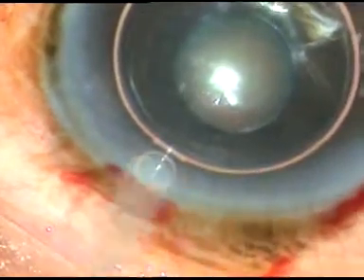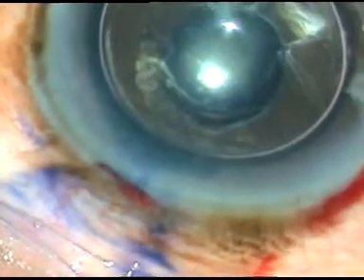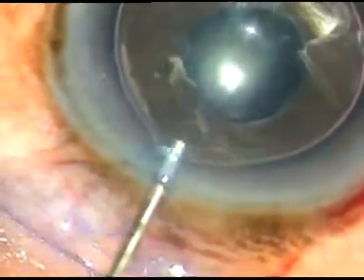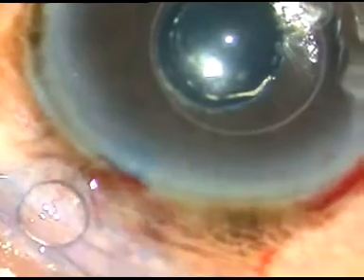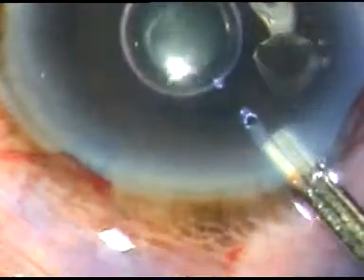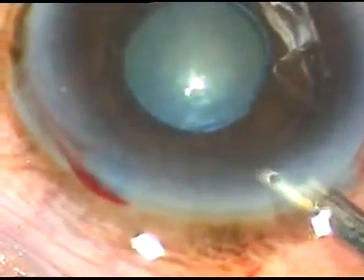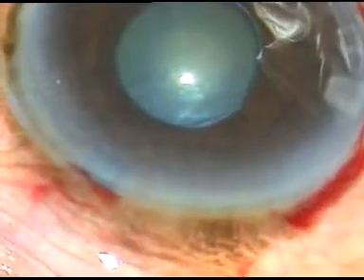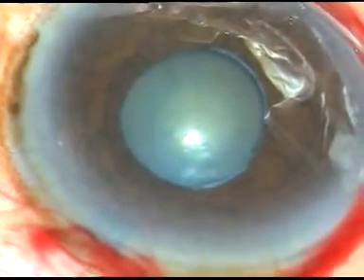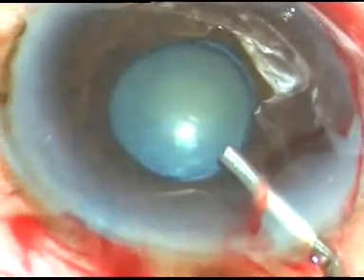Two incisions have been made — the main incision and one side port. Here goes the trypan blue dye to stain the anterior capsule. This is a bit of adrenaline to see if the pupil dilates a bit, but in vain — it didn't dilate at all with the adrenaline. I am now washing the trypan blue dye with BSS and going to use viscoelastic substance HPMC, and then use the vitreous scissors.